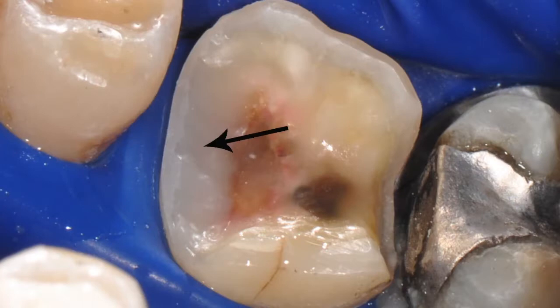Because the mesial decay went subgingival, we decided to elevate the margin of our preparation above the gum line by performing a gingival margin elevation technique as taught by Pascal Monnier. Following sandblasting, a matrix band was adapted around the tooth, and using meticulous bonding protocols, a thin layer of composite was added to allow for a supragingival finish line for our composite onlay.